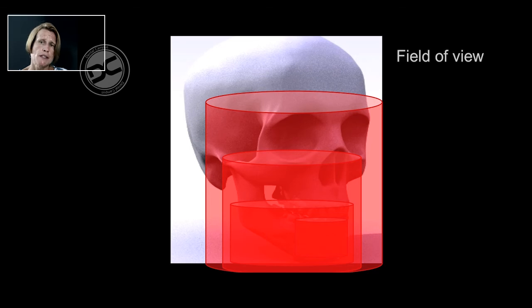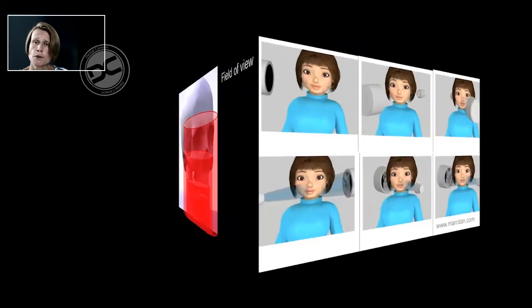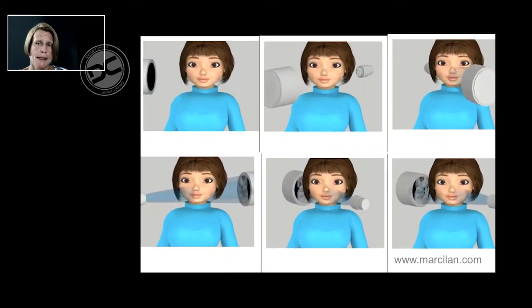Another factor to be considered is whether the radiation is pulsed or continuous. In this example, you see that with pulsed radiation, you can also obtain a 3D image. Because the radiation is not continuous, the radiation dose to the patient will be smaller, yet movement artifact will be similar as the normal rotation time will remain the same. Continuous radiation will probably yield better resolution, but also a higher dose level.